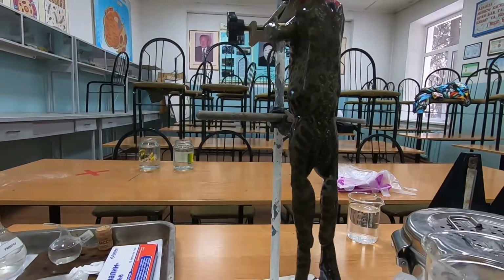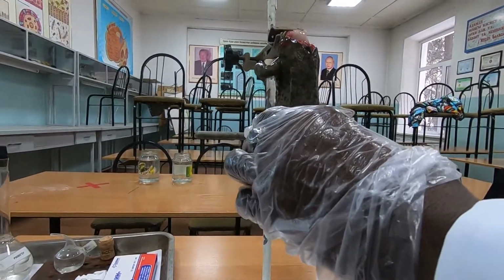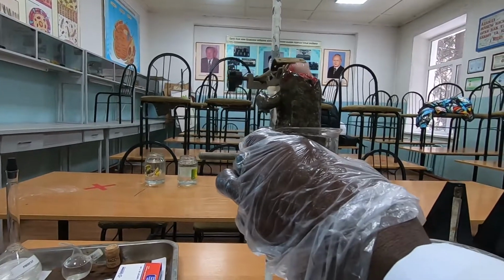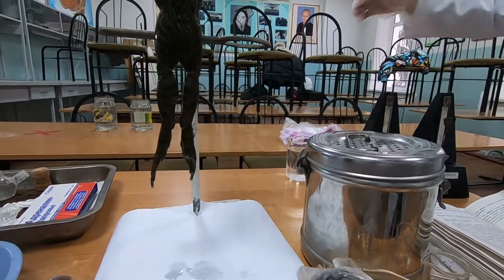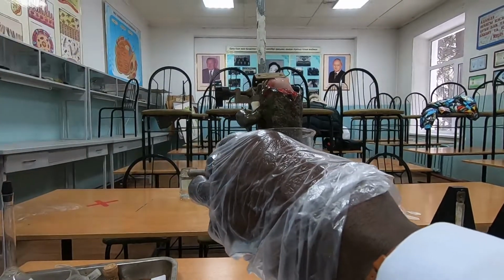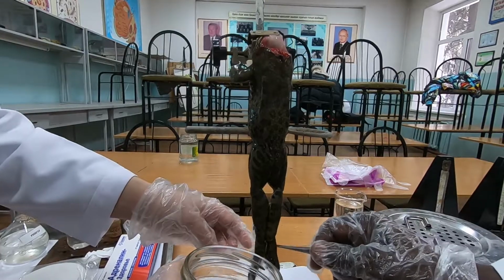Okay. Now, the whole frog, we're bathing it.